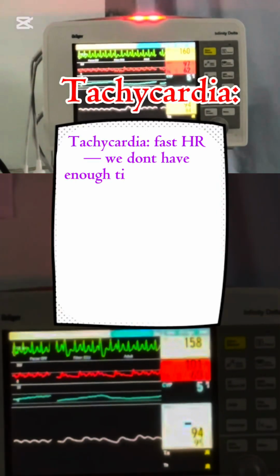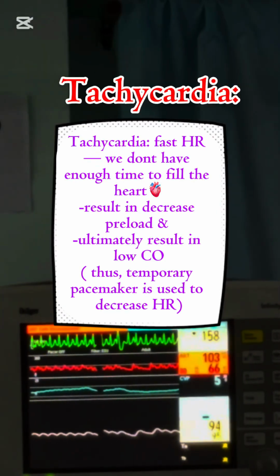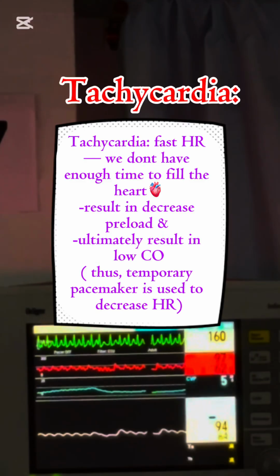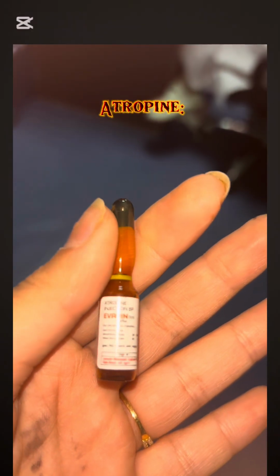And it is also used in a patient with tachycardia. Tachycardia means fast heart rate. That means we do not have enough time to fill the heart, which results in decreased preload and ultimately results in low cardiac output. So in this case, a temporary pacemaker is used to decrease the heart rate. And ideally, we use a temporary pacemaker only when medication like atropine doesn't work for the patient.